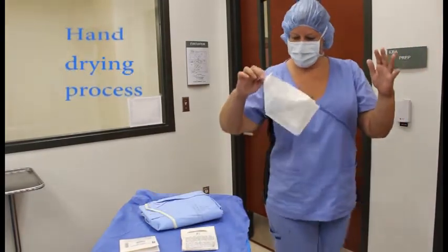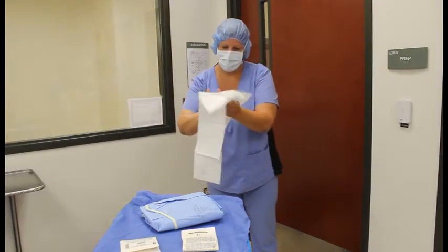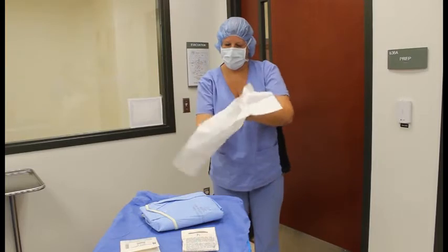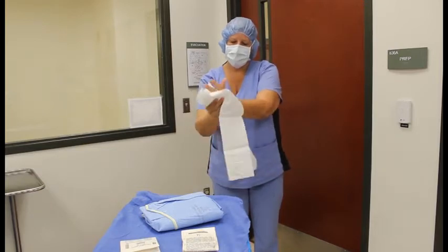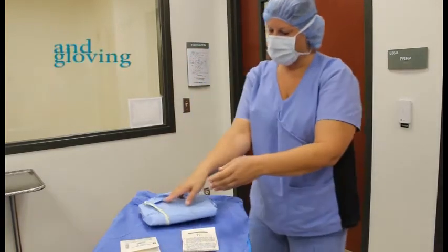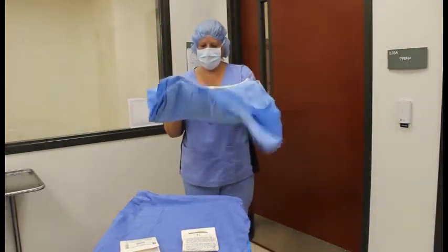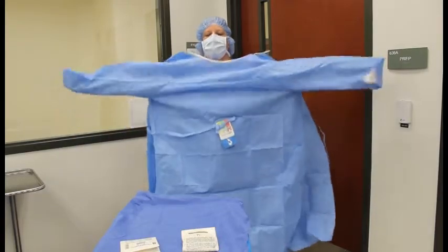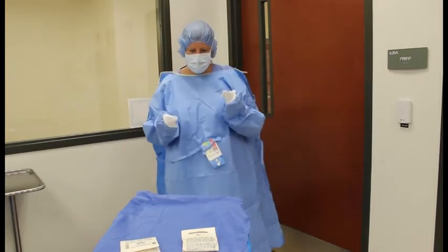First step in putting on our sterile gown is drying our hands, starting with the fingers and then moving towards the elbow. We're going to pick up the gown without touching the mayo stand and drop it in front of us, making sure not to put our arms above our head or drop them down. We want to make sure our fingers stay inside the gown.